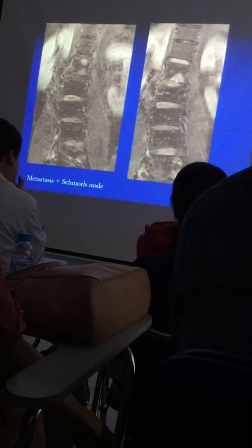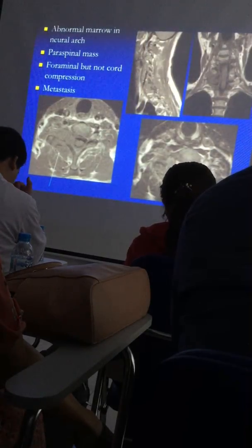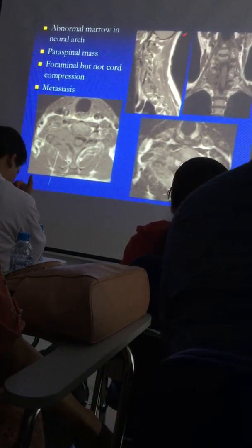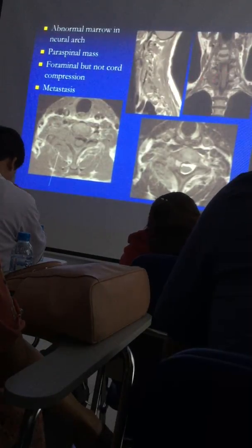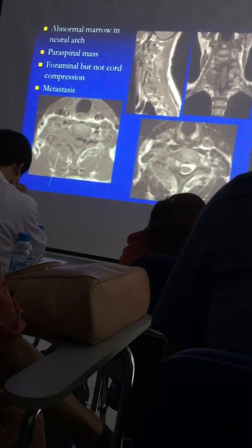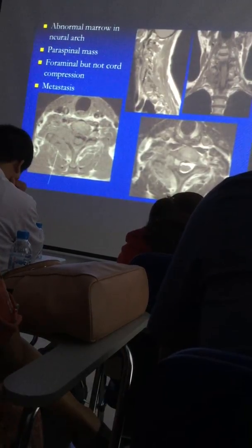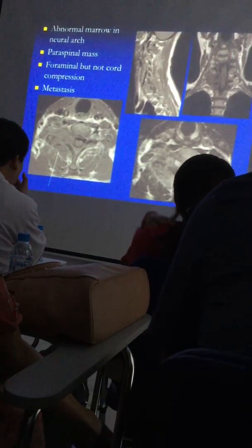Yeah, so sometimes the other plane really helps you to work out where the lesion is. Okay, so in this patient, we look at the sagittal T1s looking for the marrow, and again we can look at different planes to see which part is abnormal. The most obvious is in the axial plane here. This is at about C7-T1, I think. This is the frame on the right. Is this huge extradural soft tissue mass here, pushing the cord a little bit this way.